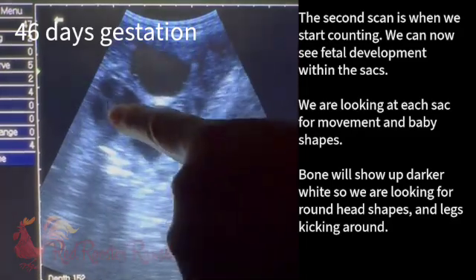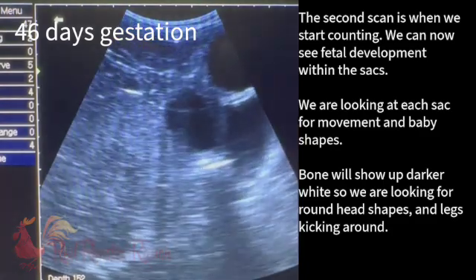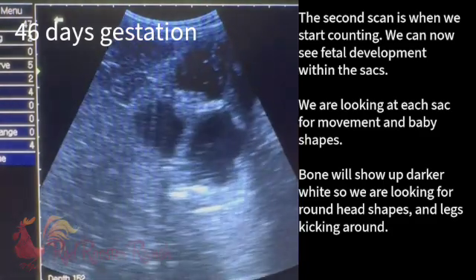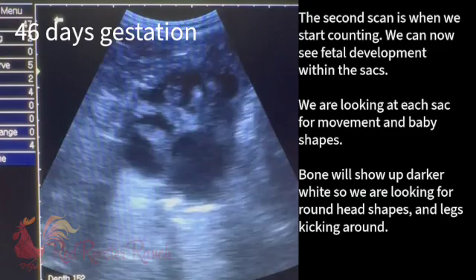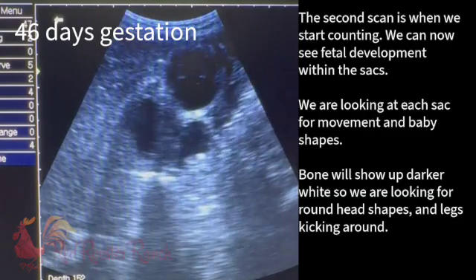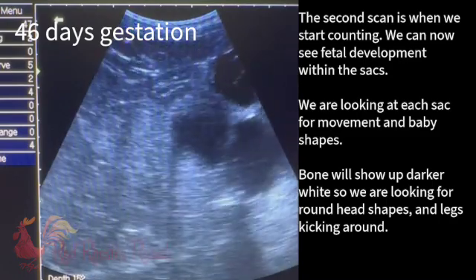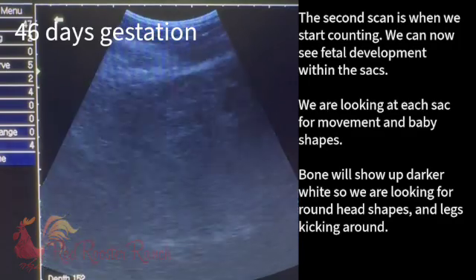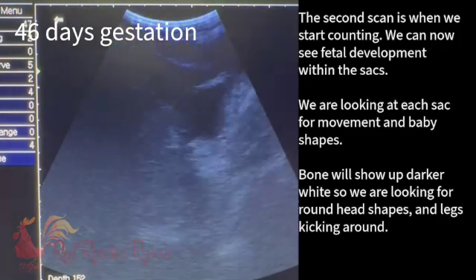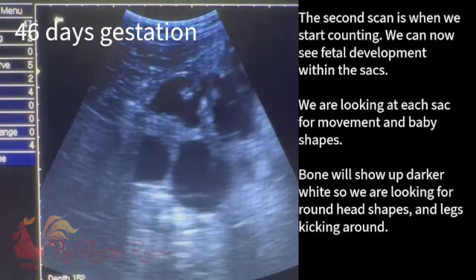I've seen a baby here. I'm going to focus on this sack for a second and then I'm going to look at that one. So definitely seeing movement. My hand is still — the goat is moving. And we definitely see movement, tiny little things. Going to go ahead and try to get the other sacks in better focus.